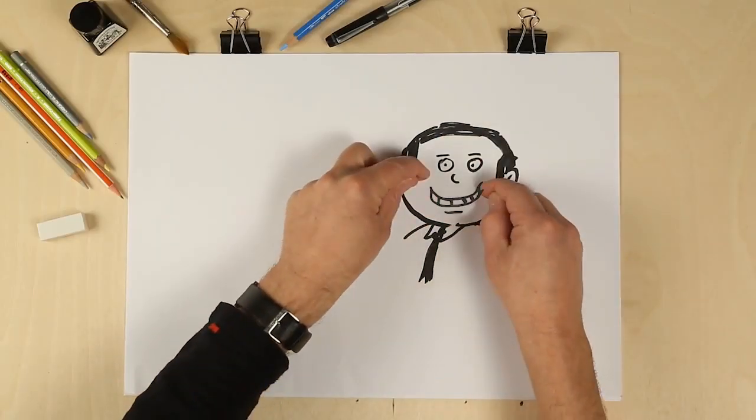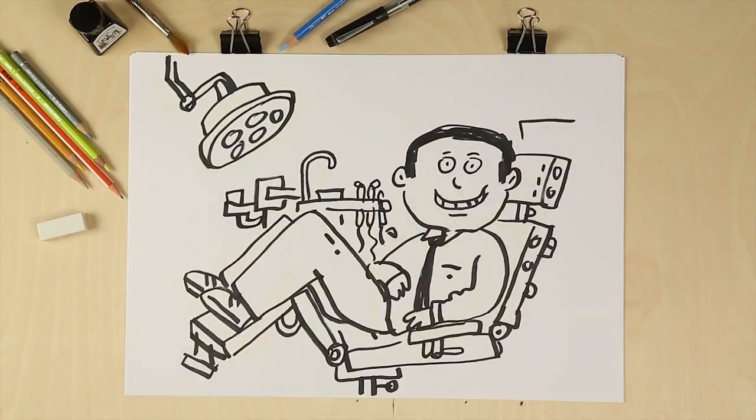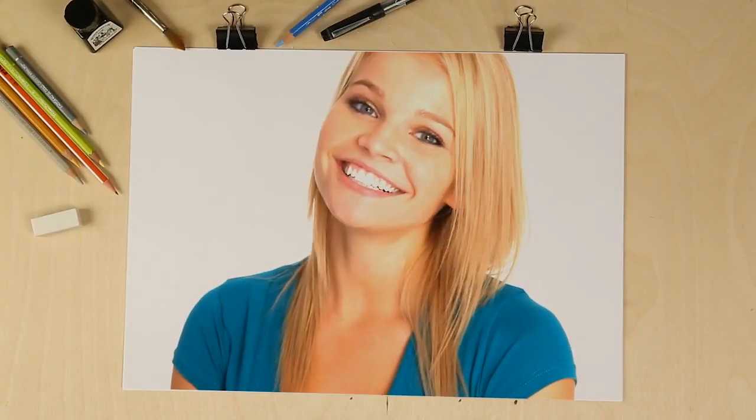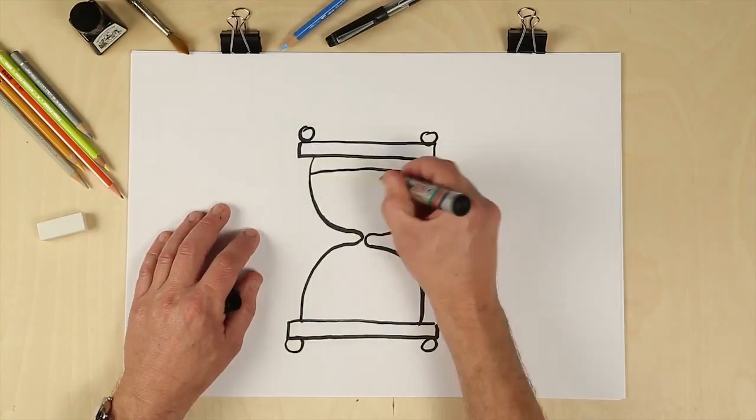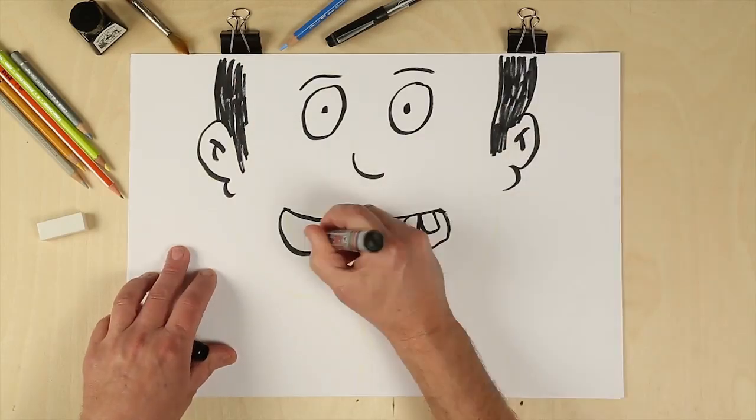Orthodontists create smiles. Face it, patients don't come to us for treatment — they come to us for results. We all know that crafting the perfect smile takes time, but by going digital we can do it much faster, more accurately, and with a lot less discomfort.